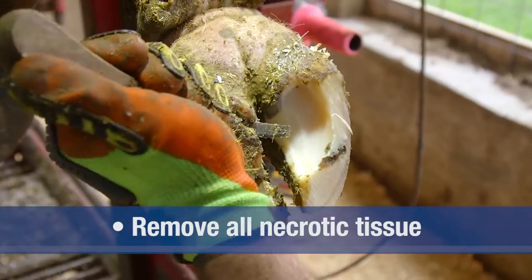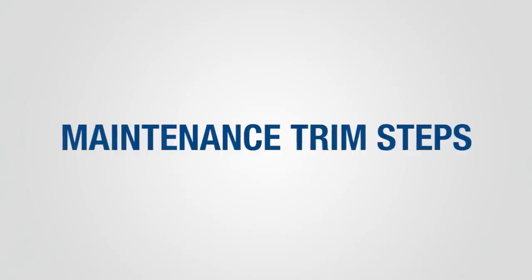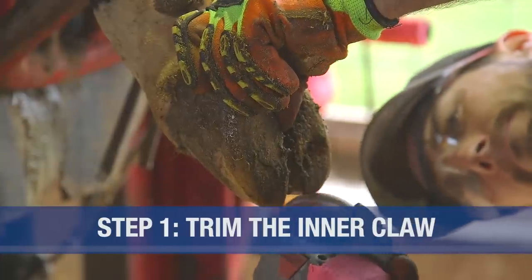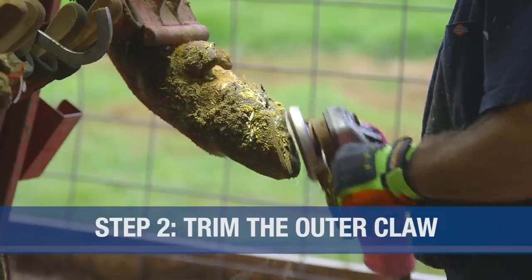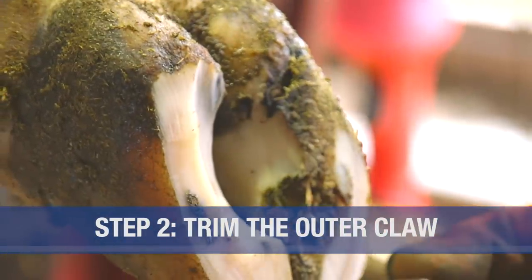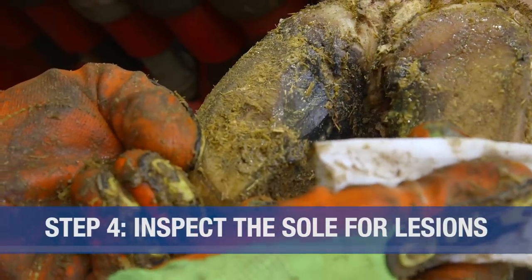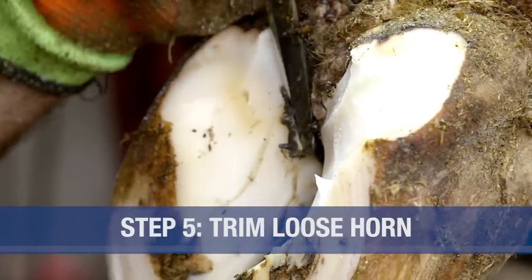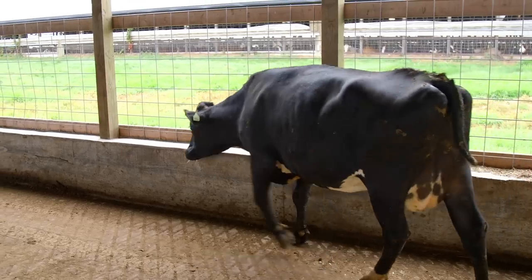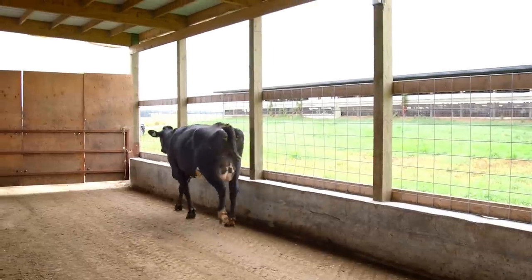Step 5 is to remove any loose horn in the heel area and trim down any visible ridges. To recap the 5-step Dutch trimming method: Step 1, trim the inner claw; Step 2, trim the outer claw and check for balance within and between the claws; Step 3, model the soles; Step 4, inspect the sole for lesions; Step 5, trim loose horn. We've now returned the claw to its correct shape and restored normal weight distribution. Correct functional claw trimming will improve productivity and animal well-being.